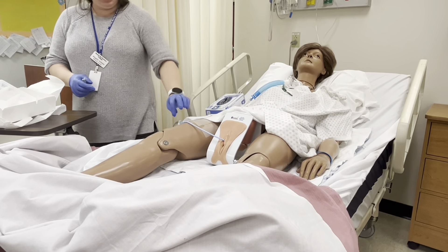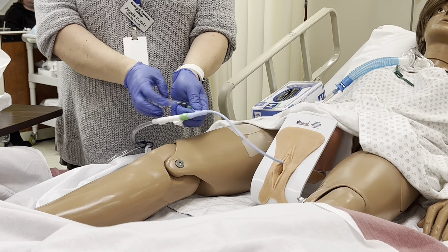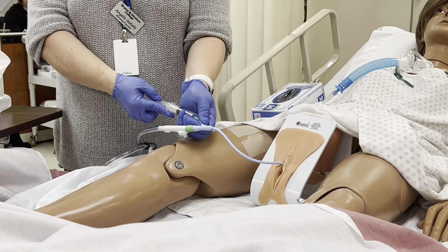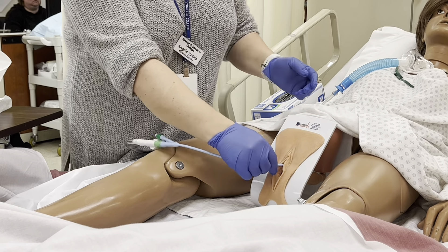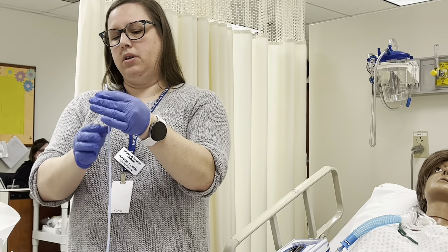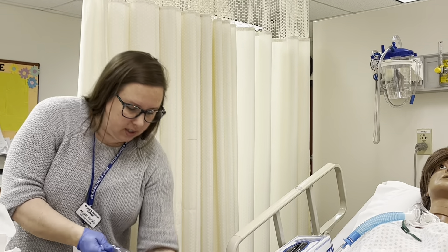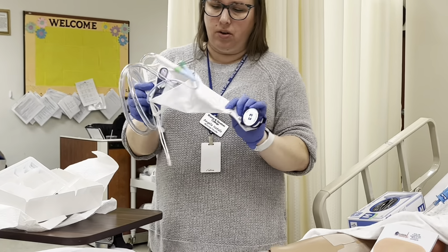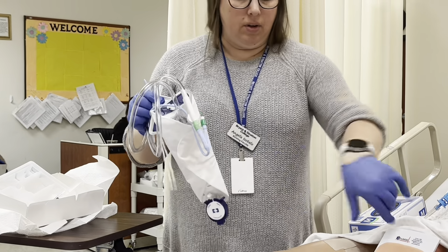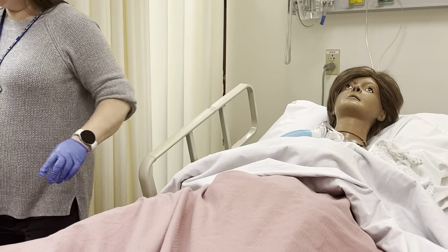I'm just going to detach it from the leg. I am going to put the syringe on the end and get out all the water. I am going to take the catheter and pull it out. I am going to inspect the tip for any blood, mucus, or signs of infection. I would have made sure that there was no urine in the bag prior — I would have emptied it out. I would clean her up and place her in a comfortable position, then throw my supplies in the trash.